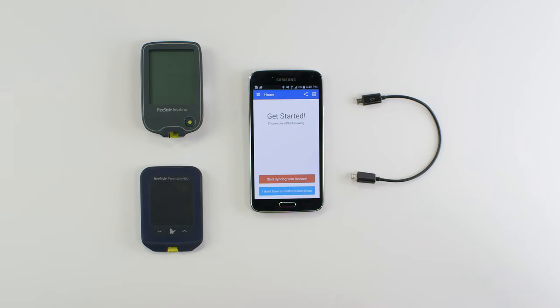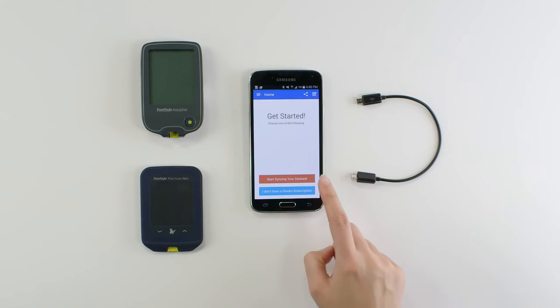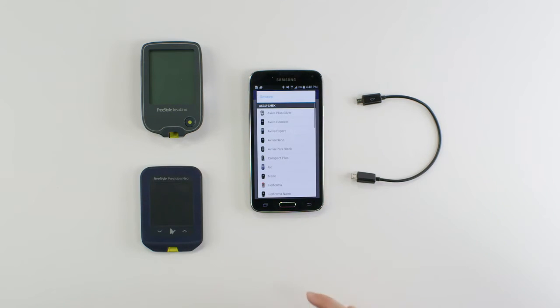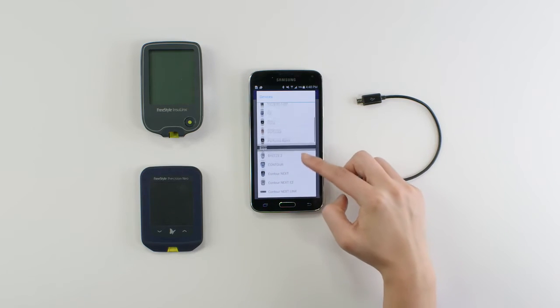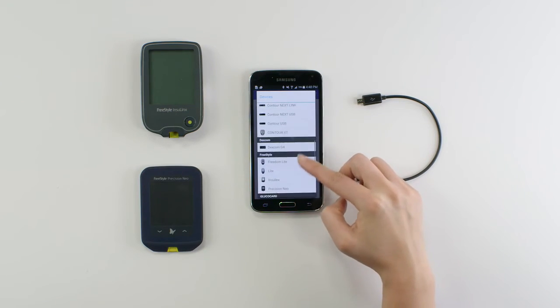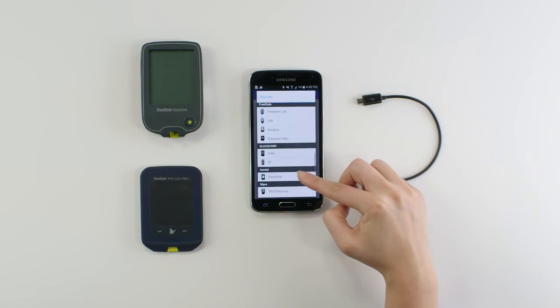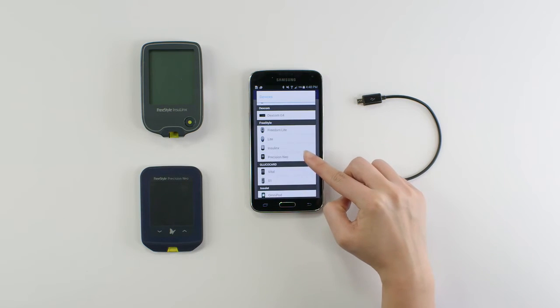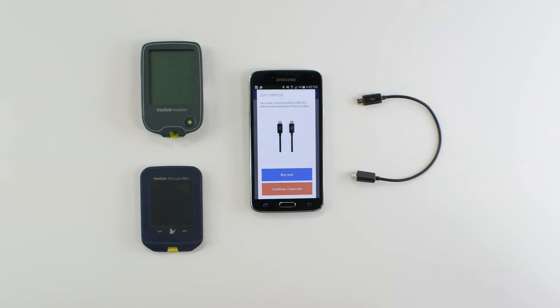From the home screen tap start syncing your devices. You'll find our list of supported diabetes devices. Scroll down until you see the freestyle section and tap the device model name to open the sync method screen.